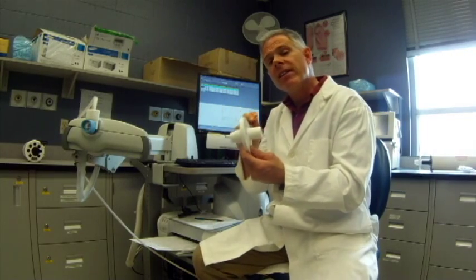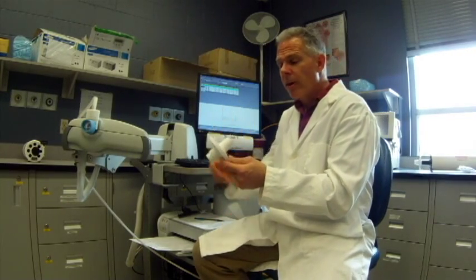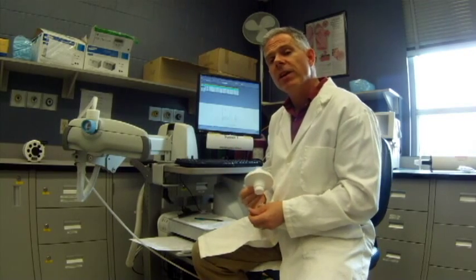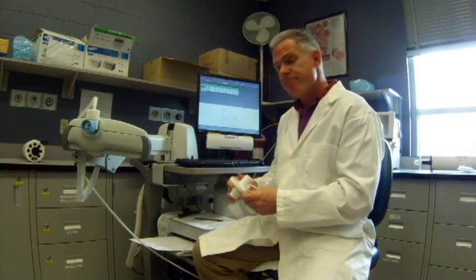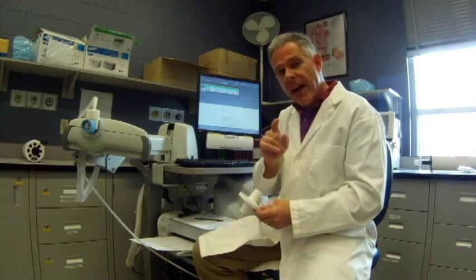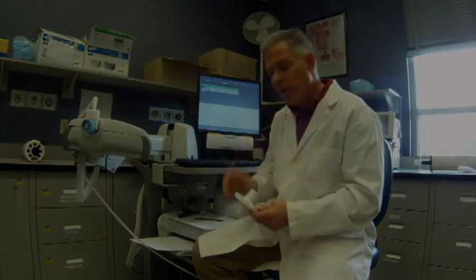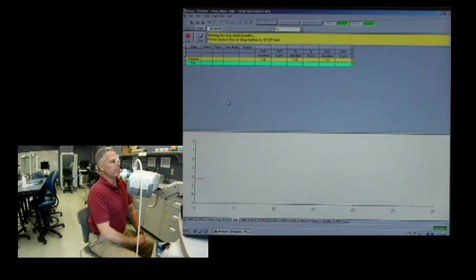We're going to look at the results on the computer so we can know if we have a good test. That's the slow vital capacity maneuver — let's try that with a patient.